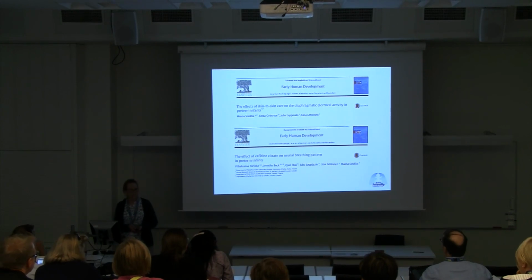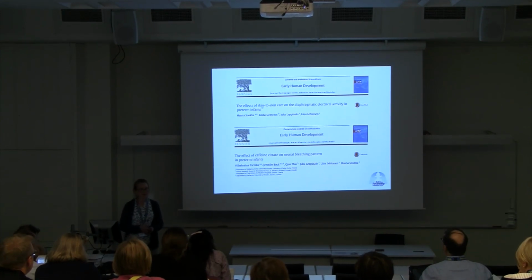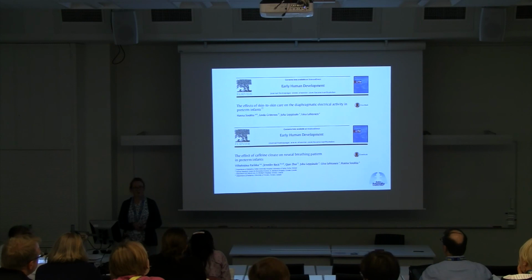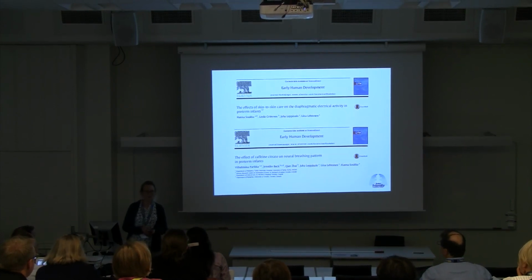Here are two publications in which, with the EDI signal, we showed that it is as easy to breathe in prone position as in kangaroo care compared to supine position. And also we showed that the effect of caffeine citrate is mediated neurally, and it shortens both short and long apnea.